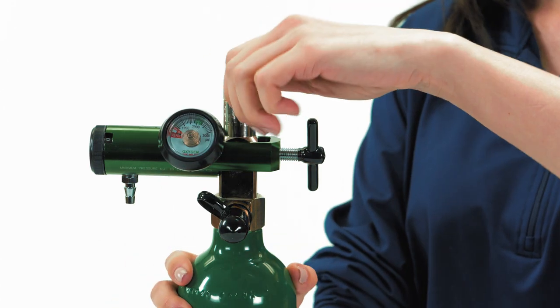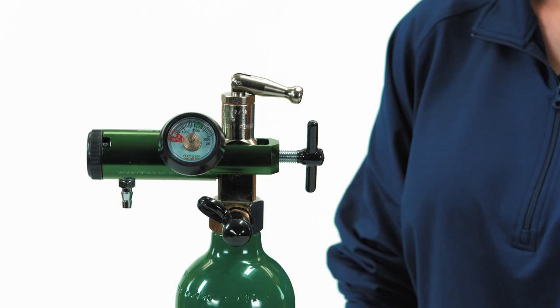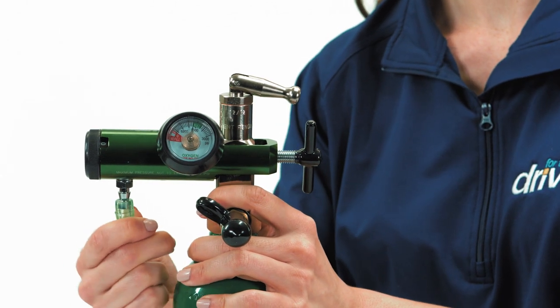Slowly turn the cylinder valve handle counterclockwise, opening the cylinder. You should hear the cylinder pressurize the regulator. If you do not hear a leak, affix the cannula and adjust the flow selector to the prescribed setting.